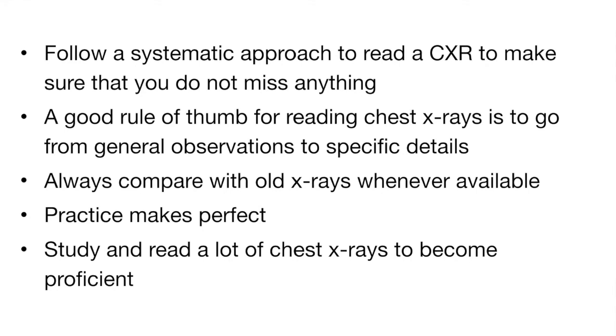So in conclusion, chest X-ray success is to follow a systematic approach to make sure you're not missing anything. You want to provide general observations and work your way to specific details. I recommend the A through I method as we talked about in this video. It's always extremely important to compare old films to the new films that you've received or performed today.